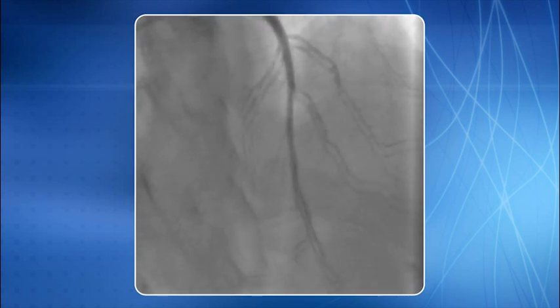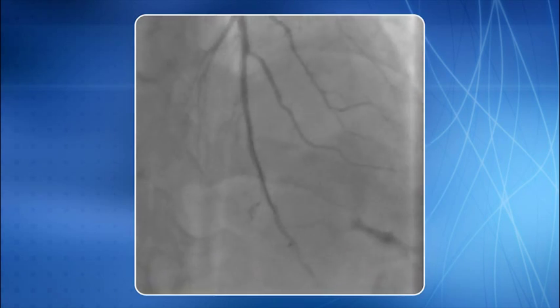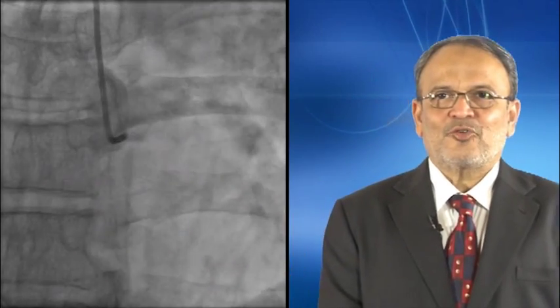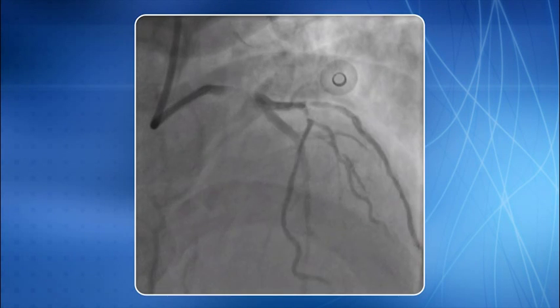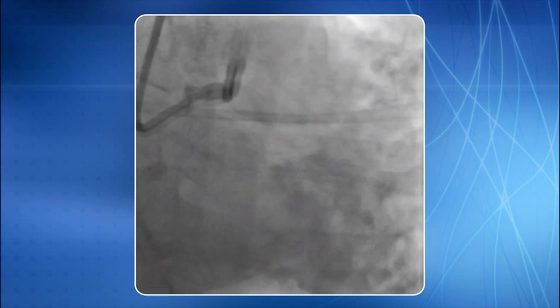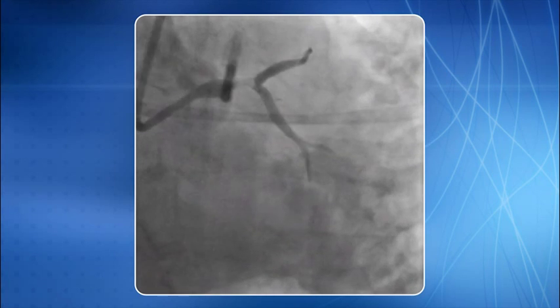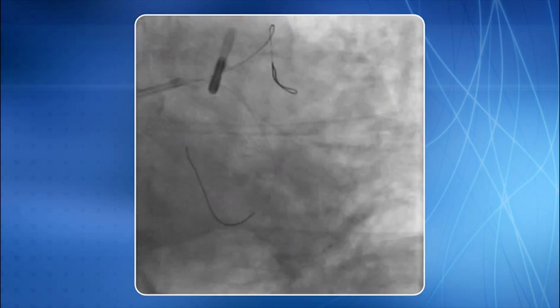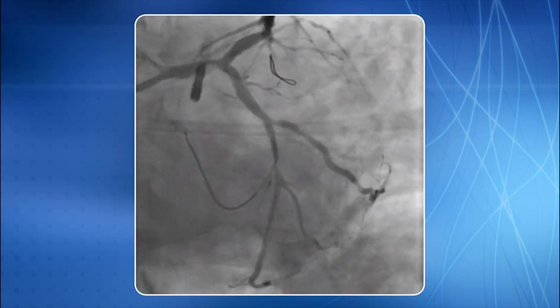You can see an excellent end result of primary PCI of the LMCA. In another case, selective LMCA injection through a 6F EBU 3.5 guide catheter reveals total occlusion of the LMCA with a large thrombus. Another view reveals partial recanalization. A large thrombus is seen at the LMCA bifurcation. IABP was deployed to support hemodynamics, and two BMW PTCA wires were deployed — one in the LAD and one in the LCX.